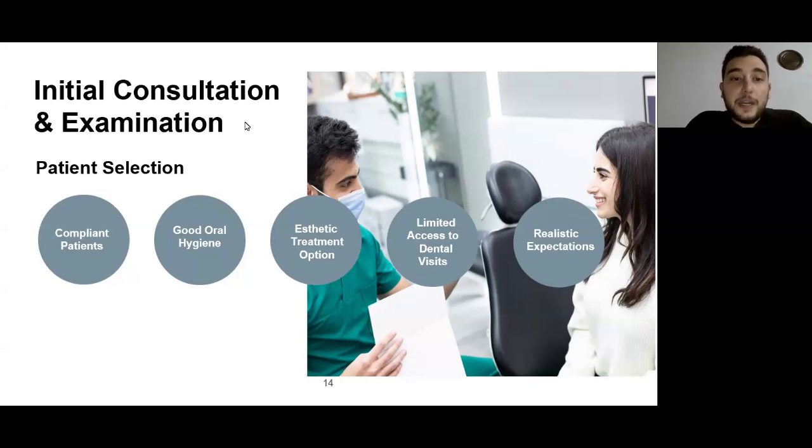Finally, with the hype that's been going around clear aligners in recent years, there is a lot of talk about clear aligners being faster, or having a shorter treatment duration in comparison to fixed orthodontic appliances. And while this may be true in a lot of cases, and a lot of studies show that many malocclusions can be treated with aligners in a shorter treatment duration compared to fixed braces, it's always important to know that these aligners are not a magic tool. If it is a severe case, for example a severe deep bite, and you're planning to fully correct it with clear aligners, it is not going to be fixed in 4 to 6 months, whether with clear aligners or fixed braces.